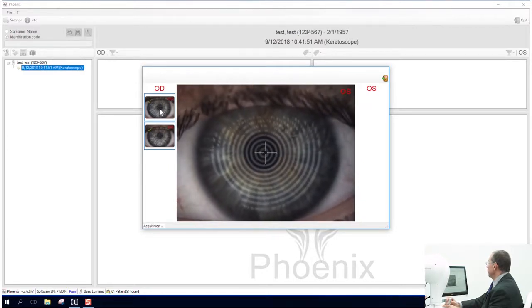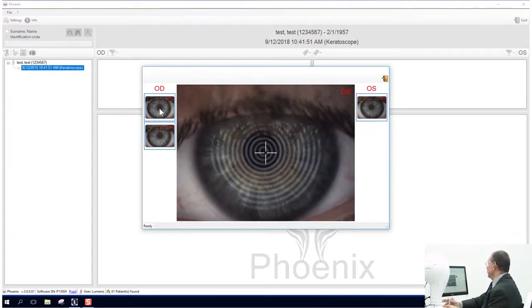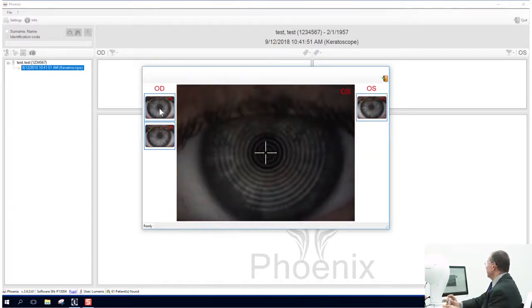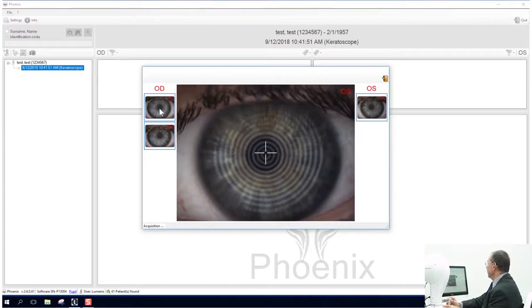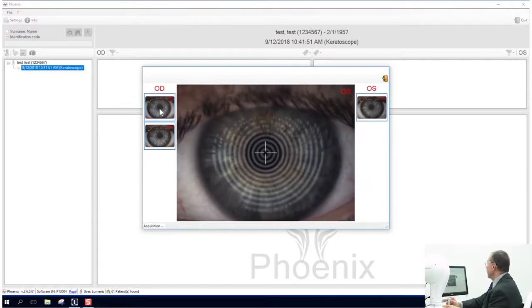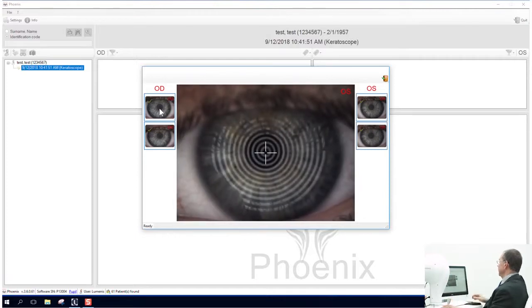You'll notice that I talk to the patient, that's great, keep it up, that's perfect. And we're going to do another one to try to allow the patient to blink before we do it. And we're going to click and keep your eyes open, wide. That's great, you're doing fantastic, wow, excellent.